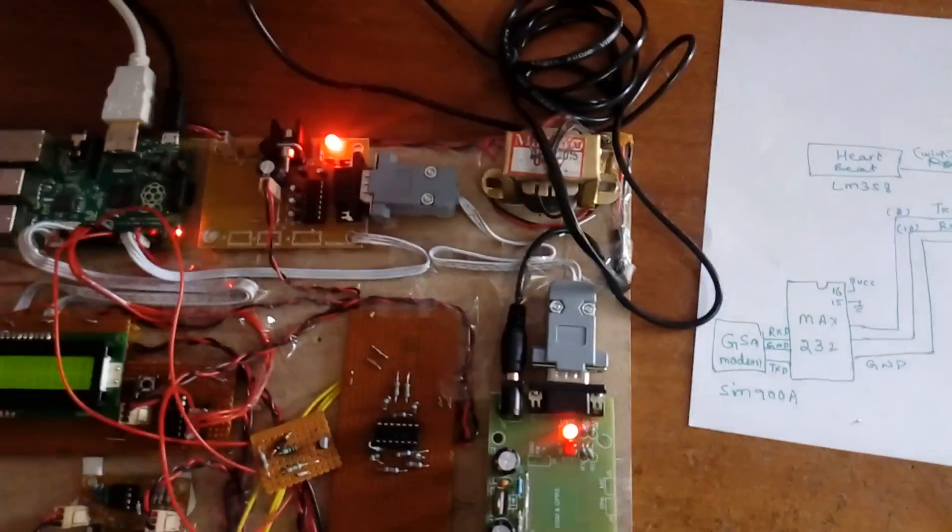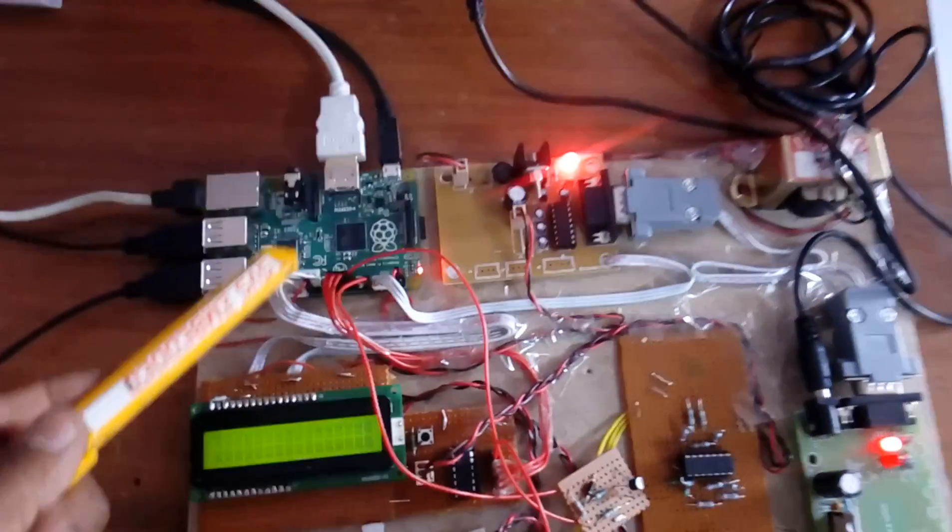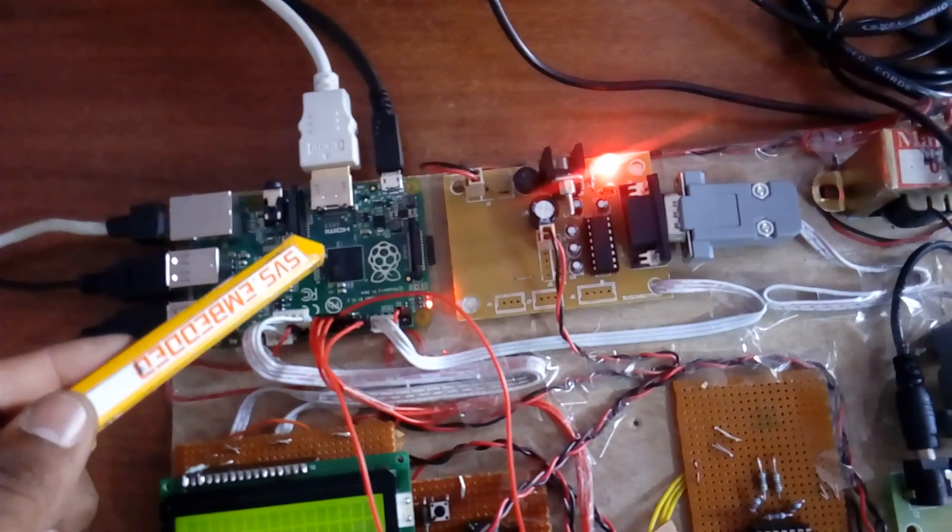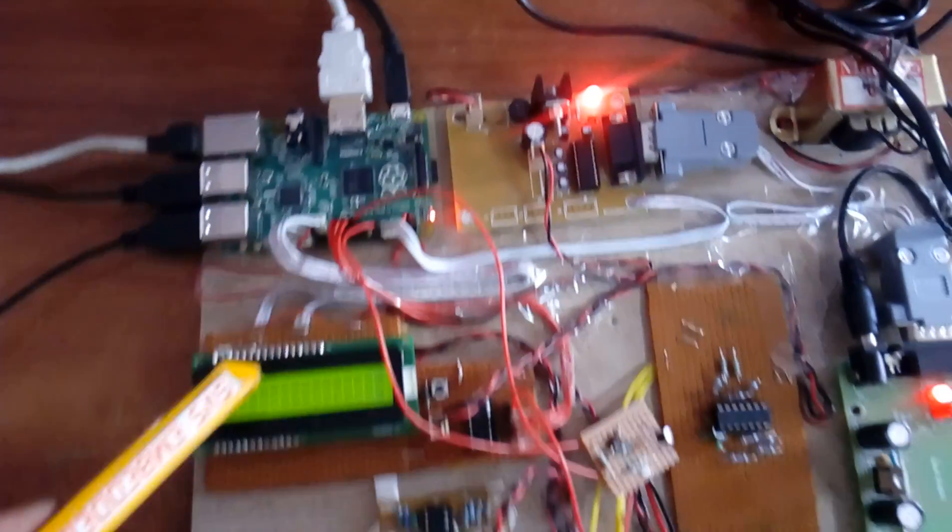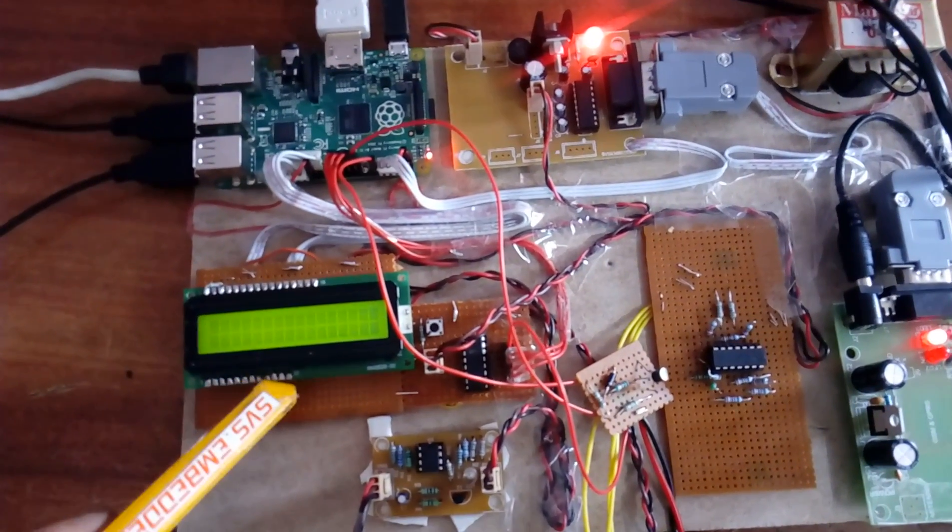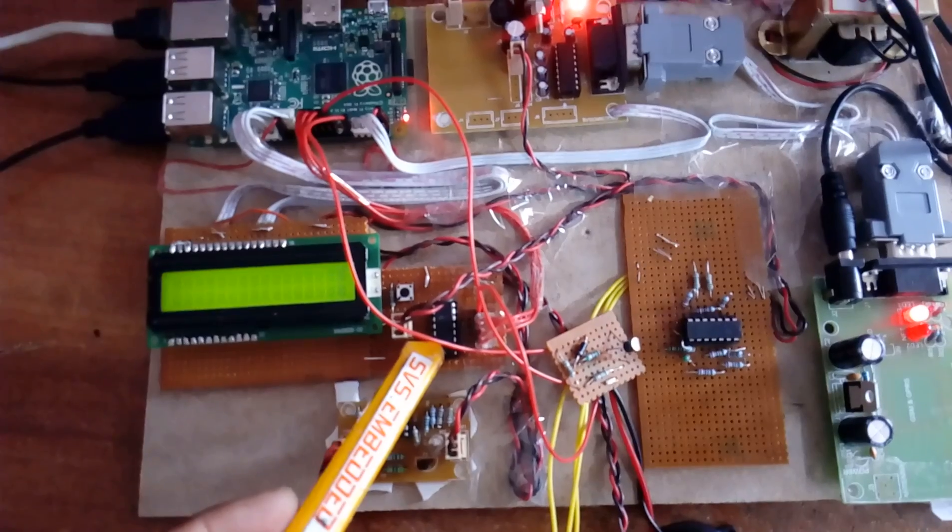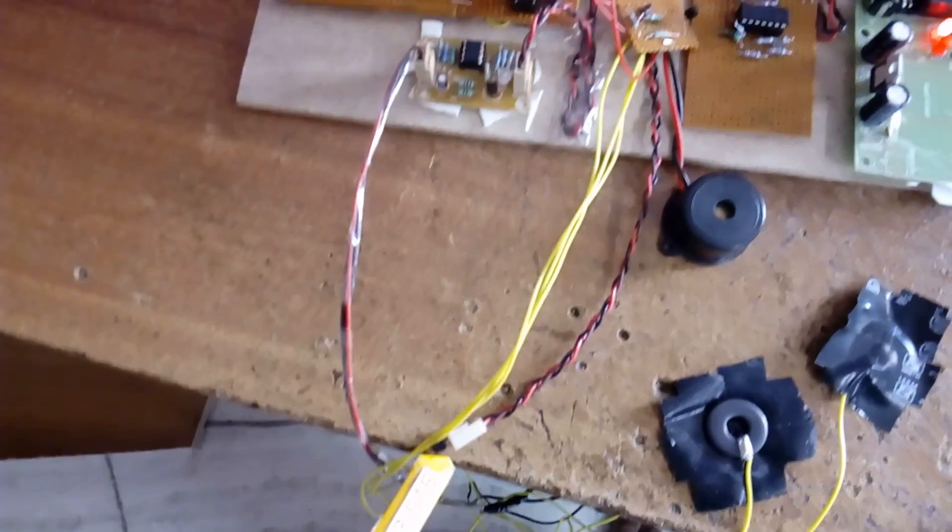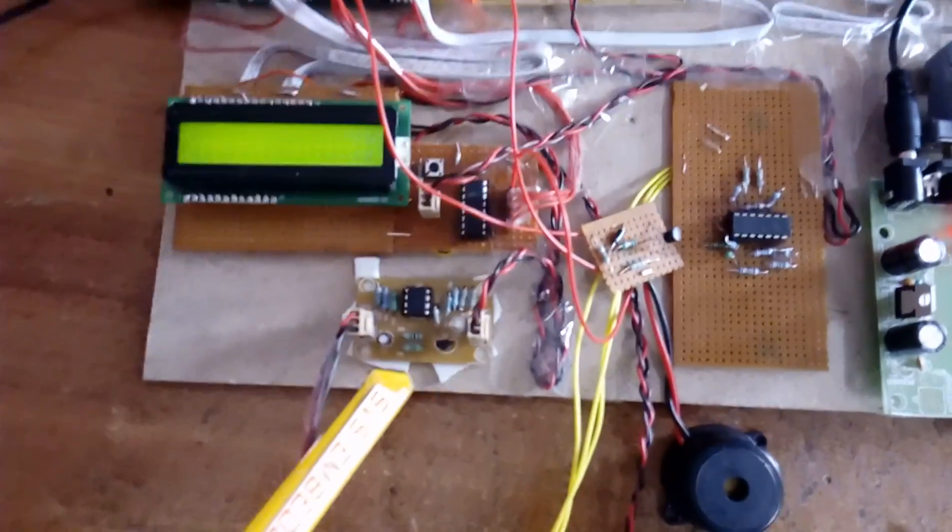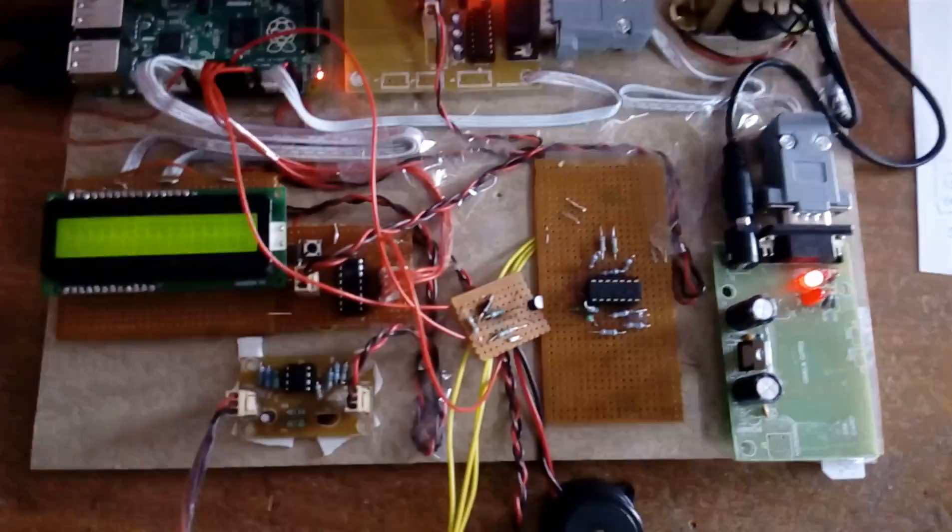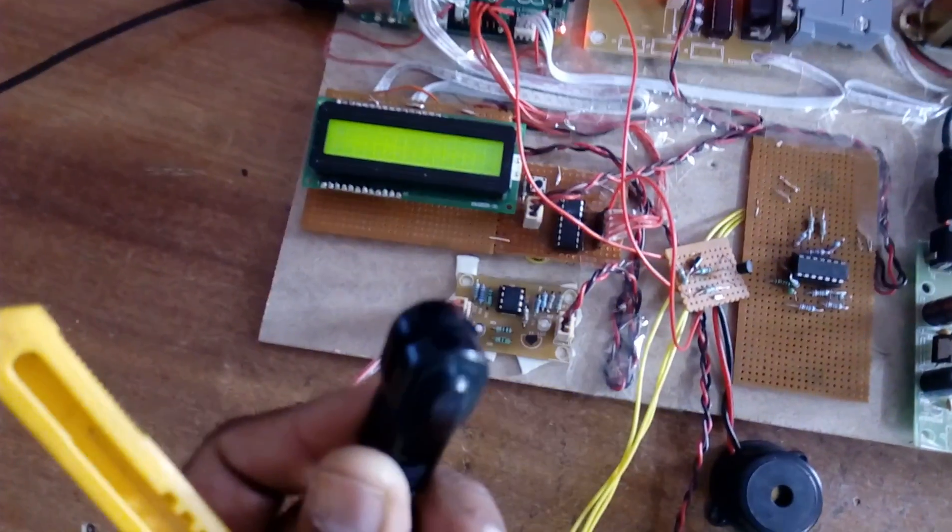We are going for the hardware kit schematic first. We are using a Raspberry Pi B plus module, 16x2 LCD display, an MCP3208 ADC, one LM35 temperature sensor, and one heartbeat sensor. This is an LM358 operational amplifier heartbeat sensor.